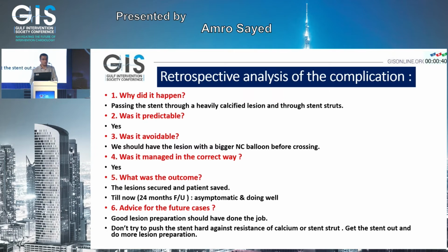What is the advice for the future? Here, good lesion preparation should have done the job. And don't try to push the stent against any resistance or stent struts.